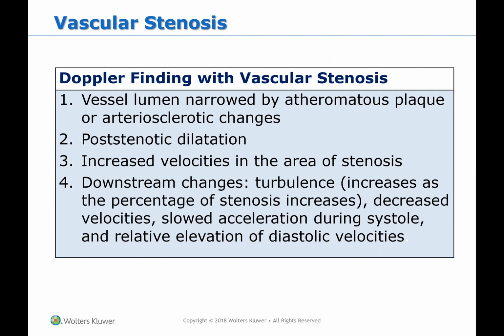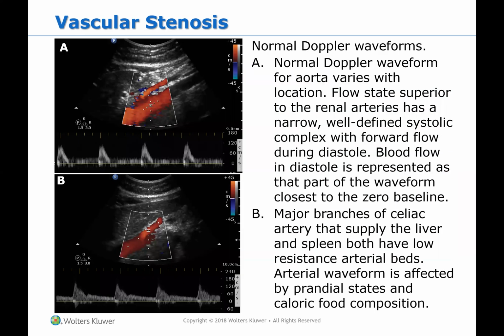There are different changes. You're going to see post-stenotic dilatation, increased velocities in the area of the stenosis, and downstream changes. So, like turbulence, decreased velocities, slowed acceleration, and relative elevation of the diastolic velocities.